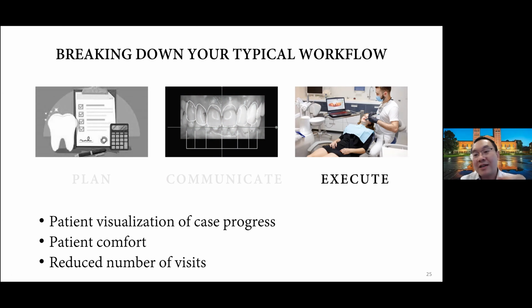Patient is holding up their own mirror, so you have to hold up your mouth mirror to show the patients how that looks in the patient mirror, right? So all of that is gone. Now they can visualize the 3D image, and it's much easier, right? And they can see the tentative crown design.